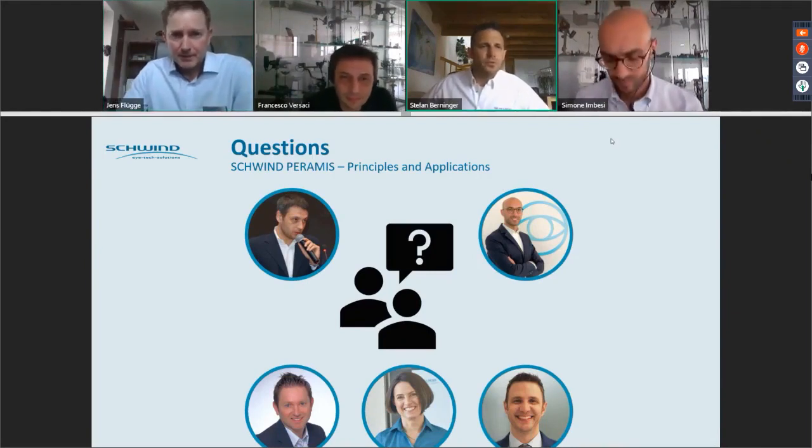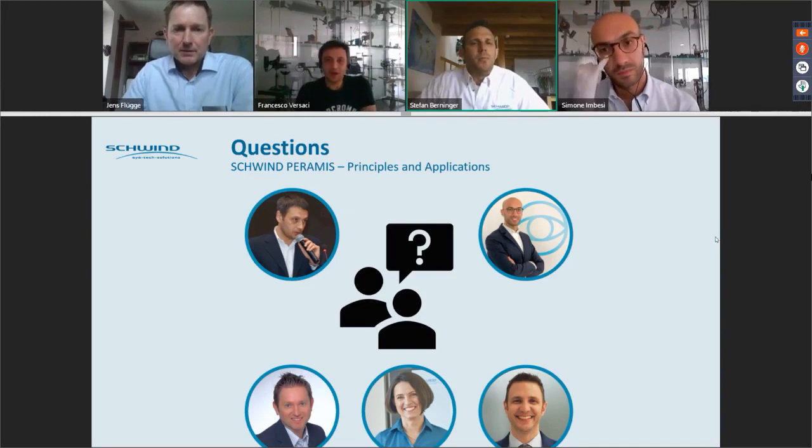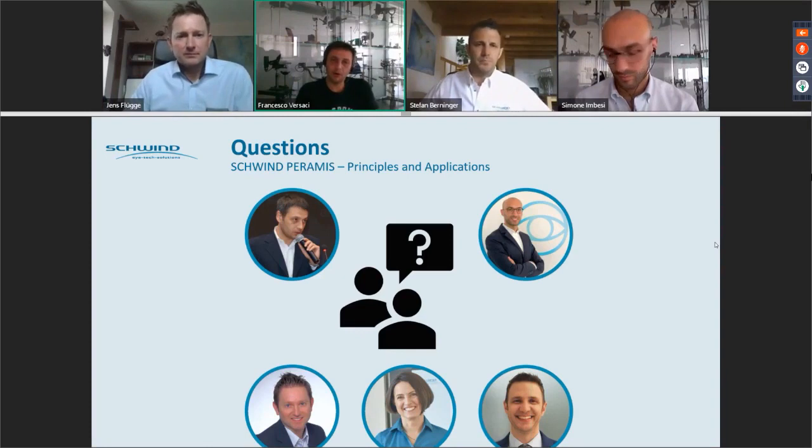The first one is, what is the source of error in such measure? Does dry eye affect the accuracy? Yeah, dry eye can absolutely affect the accuracy of the measurement, because if I have some breakup of the tear film, the light will pass through this corrupted part of the tear film, and the measurement won't be good.